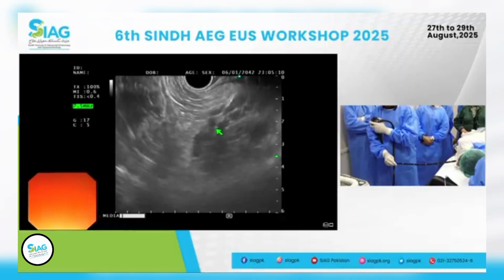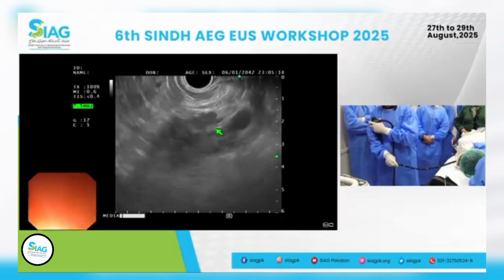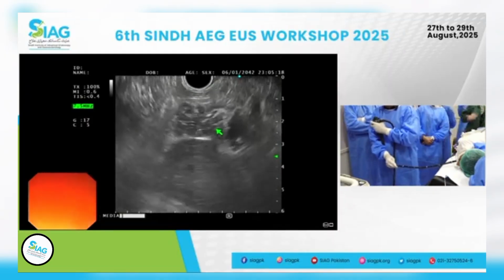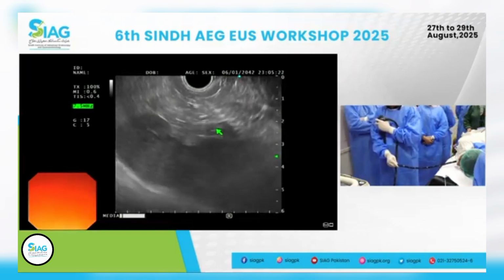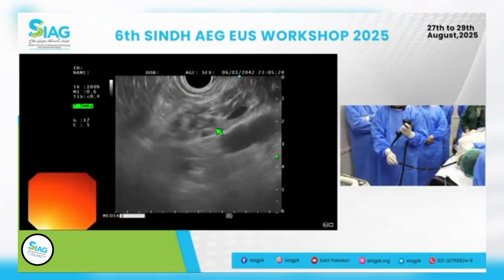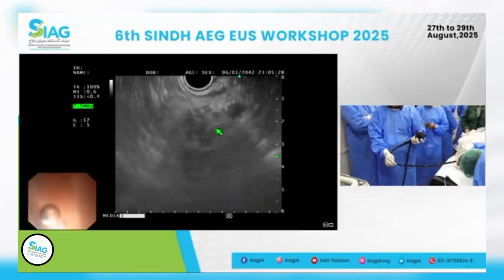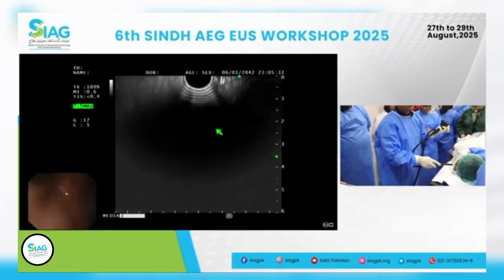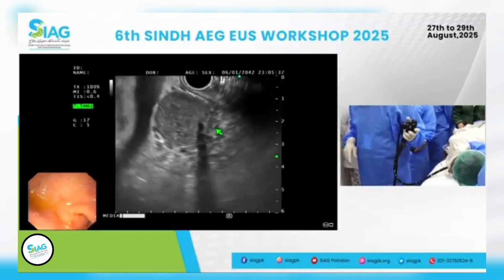Now I fell into the stomach, but I still have the pancreas with me. And just from there, big wheel towards me, you see the spleen right at the bottom, going there, and that all the way to the tail of the pancreas. From there, right there, again, all the way to the mass there. So what I'll do is, right now, we will go to the duodenal bulb and do a biopsy of that mass. Needle ready? Yeah. Okay.